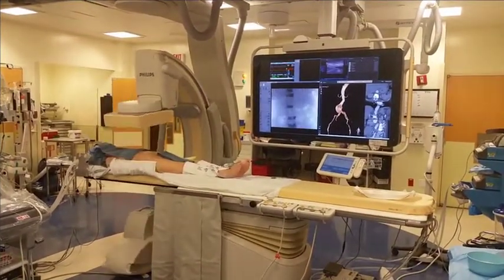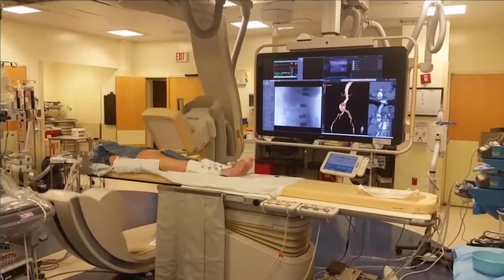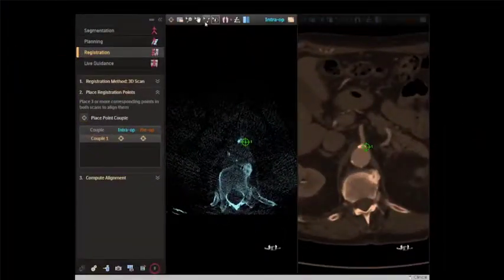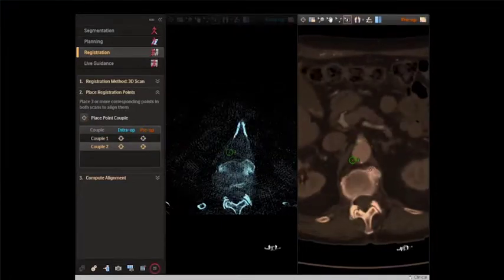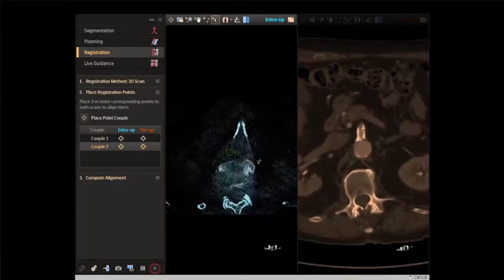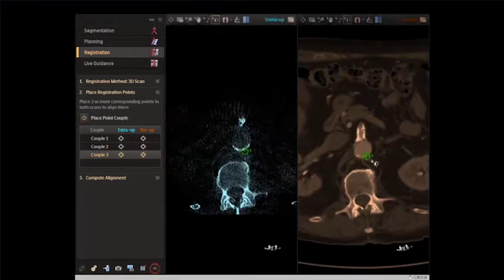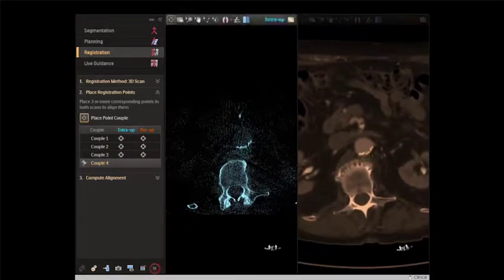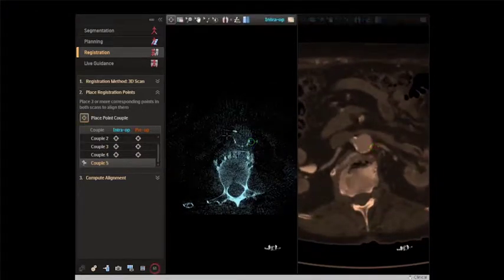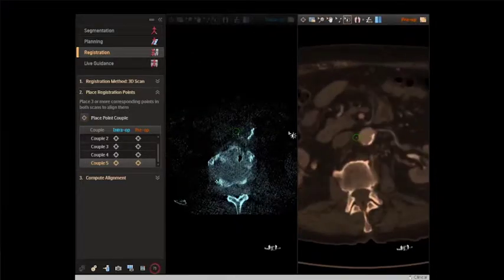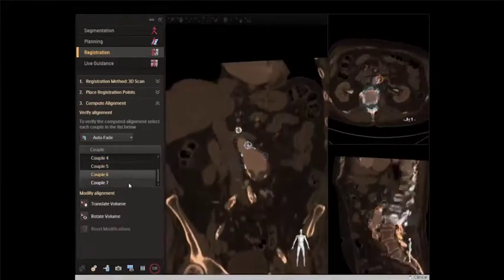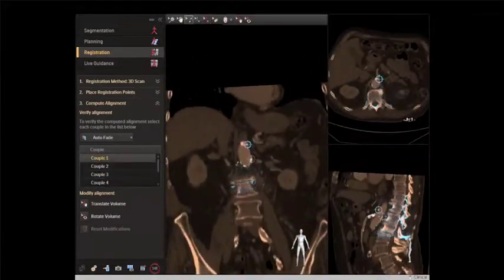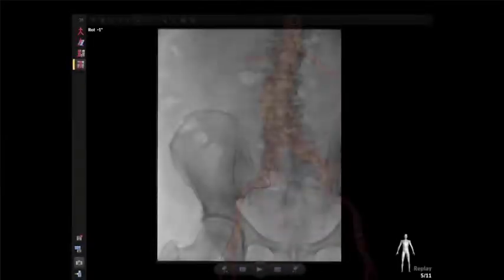We then do a quick fluoro CT spin with the patient on the table. We take that fluoro CT on the left and match it to the preoperative CTA on the right by finding pairs of calcium deposits identified on each that are in the exact same location. We need at least three matched pairs, but I typically do six or seven, focusing on the visceral renal segment, and then double-check that all of these overlap once the system is set up.